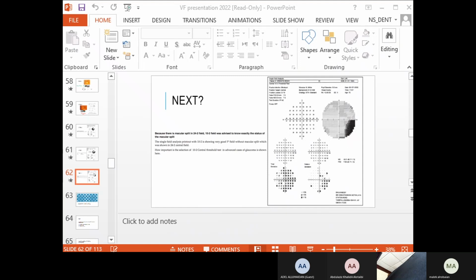What do you see in that total deviation? Do you see some change? Would you describe this? Yes, describe it. What does it mean? Is it nasal? No. Where is it? How about the pattern? Let's go. Could you help him, please? What's the definition of scotoma?